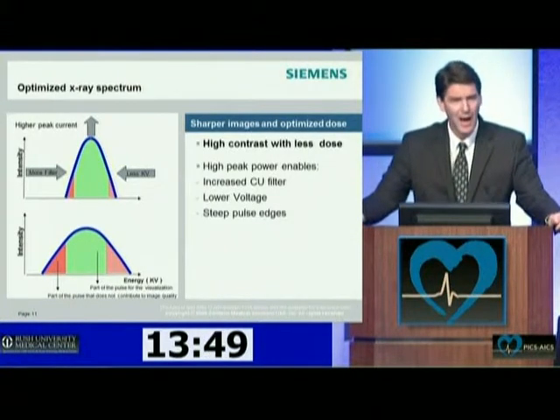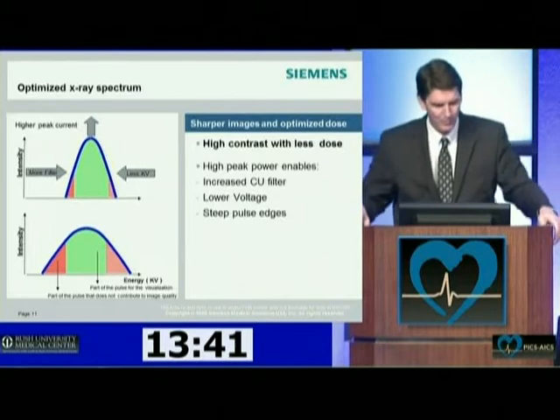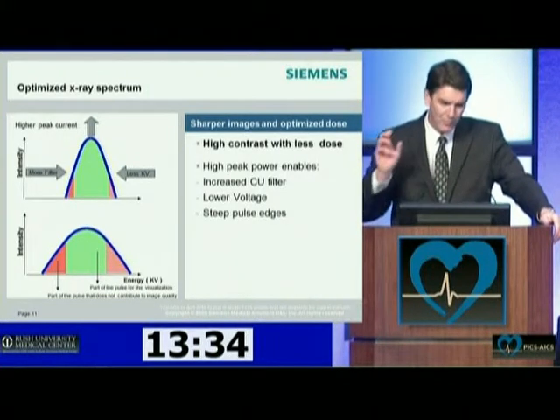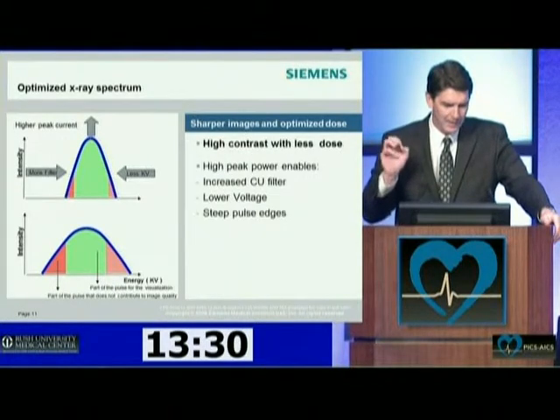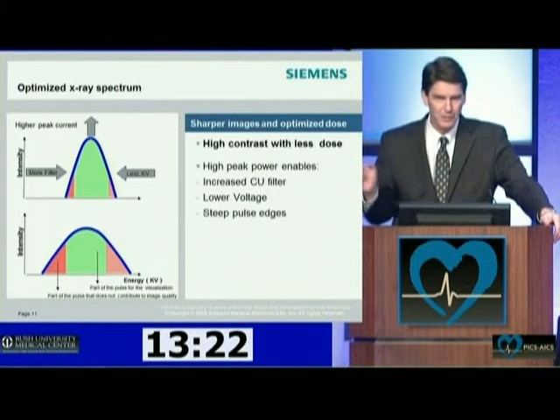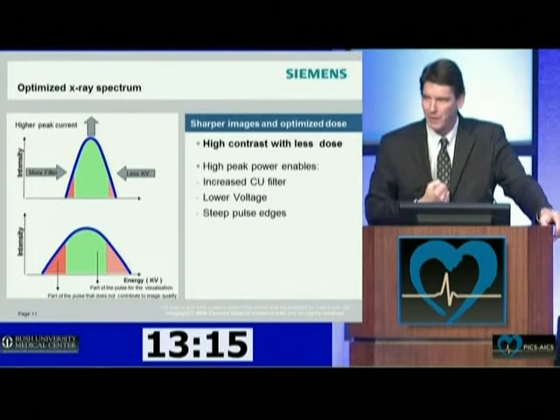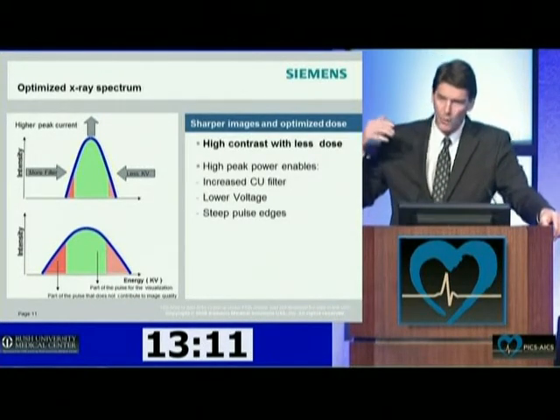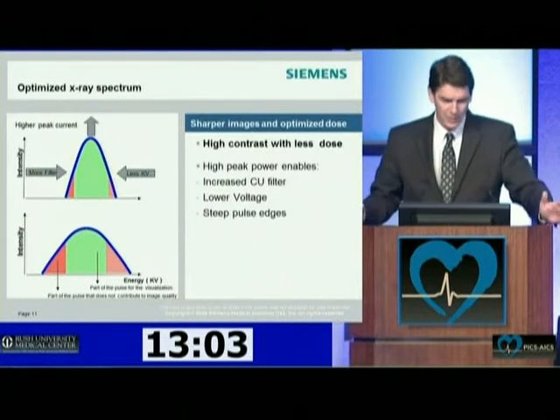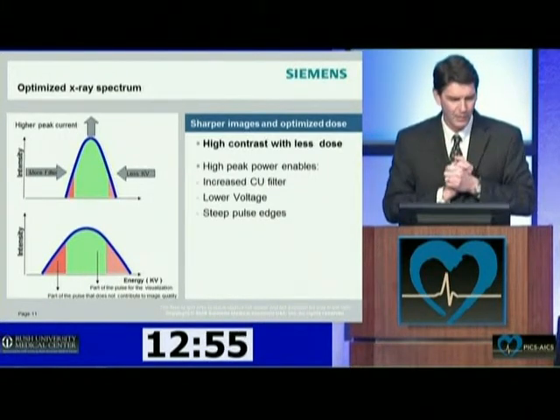The significance of having higher output from the X-ray tube is that you can really tweak this energy spectrum that goes to making up the radiation pulse. So if you look at these images, which are unfortunately once again very much engineering driven, the green component of that X-ray beam is actually the part which translates to useful image information. But within the spectrum of every X-ray pulse, we also have components that either, on the low energy side, are just absorbed by the patient and don't give any valuable contribution to the image, or on the high energy side, they simply go through the patient and the detector and also don't translate to any benefit in the image. So the objective is to narrow down that pulse so that the vast majority of it is just the green part of the pulse.